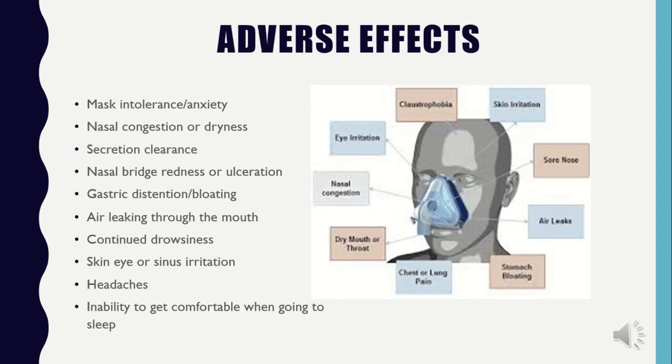Our next slide includes any adverse effects that our patients could possibly have with the BiPAP machine. Of course, mask intolerance and anxiety is something that they could have. Nasal congestion or dryness because of all that air being pushed into their oral cavity. They might have difficulty in secretion clearance. Also, with their nasal bridge, there could be an ulceration formed or redness. We want to continuously assess for that.